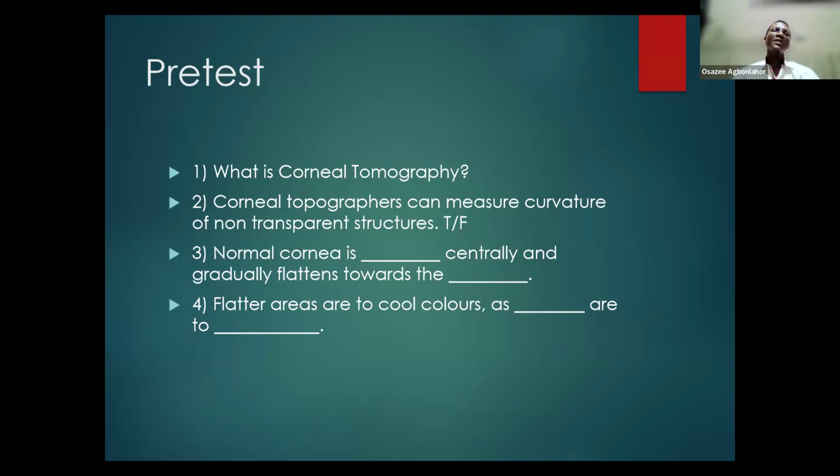But when you talk about tomography, you are looking at both the anterior and the posterior. I actually give an example of the OCT, which is called a tomogram, or optical coherence tomography. You and I know that for OCT tomograms, especially the retinal tomograph or even the corneal tomogram, it is actually both from anterior to posterior.